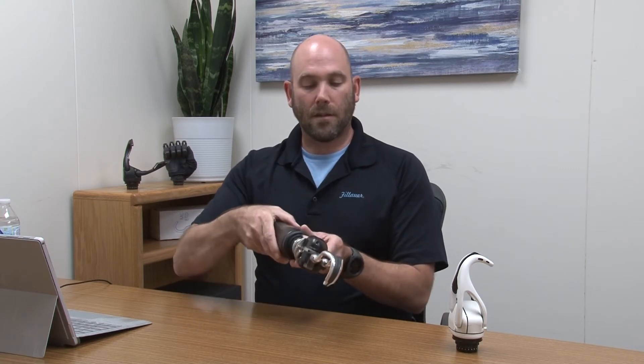If you look at the device, there is an on/off switch here. We simply push this switch outward to turn the device on, and then push it inwards or towards the body to turn the device off.